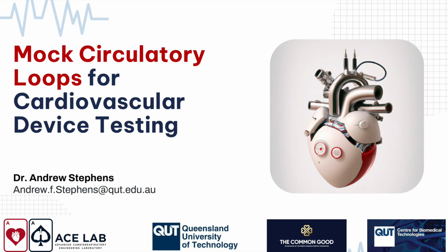So some other in vitro models other than mock loops, here is a PIV rig. And basically this is a clear ventricle that's been molded. They seed the ventricle with little reflective particles. They shine a laser onto the particles and induce a flow. And then using a high-speed camera, they can track the movement of the particles and look at the flow dynamics.